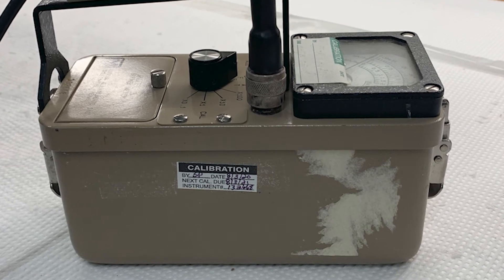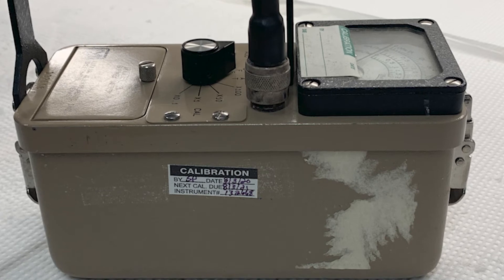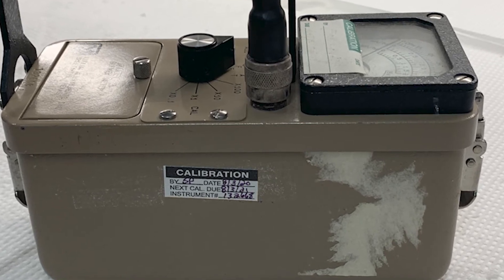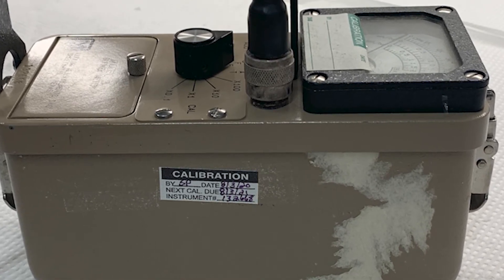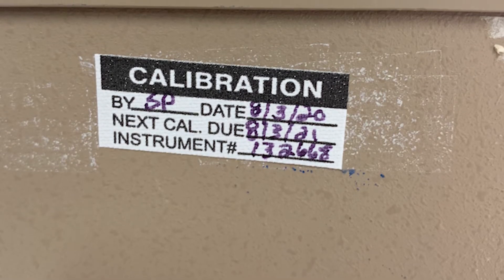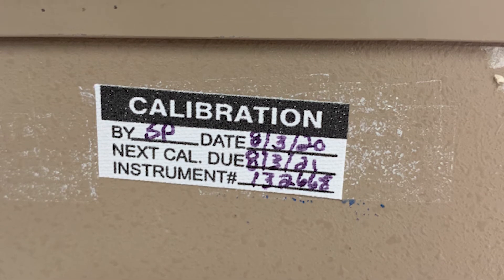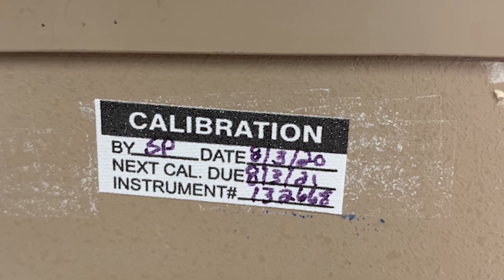Before you use the survey meter, verify the survey meter is in calibration. The survey meter will have a sticker on the side of the instrument with the calibration date and the calibration due date. The date of use of the survey meter must fall within these dates. If not, replace the survey meter with one that is in calibration.